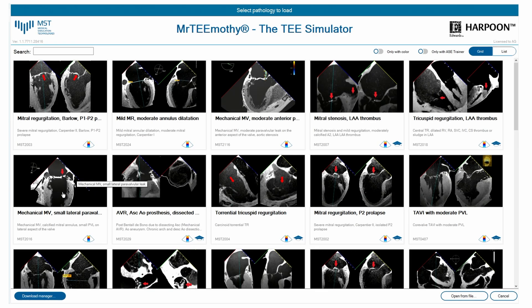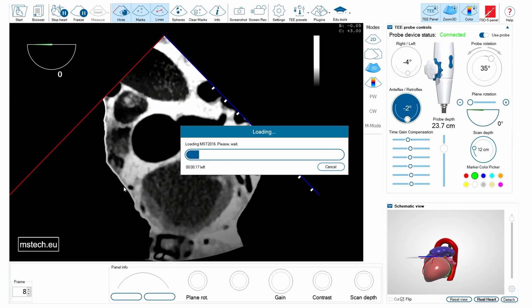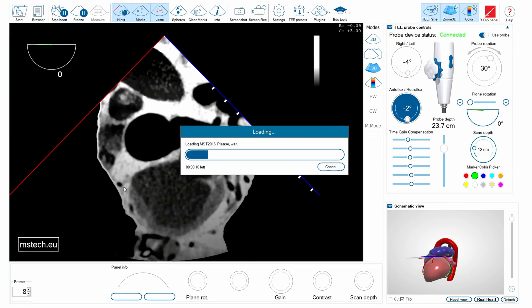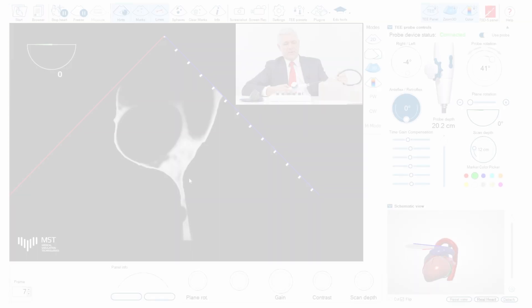Let's select another patient from the library of Mr. Timothy T simulator. It's going to be a patient with a mitral valve prosthesis. Let's see how the valve works.